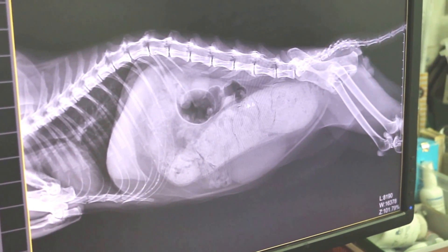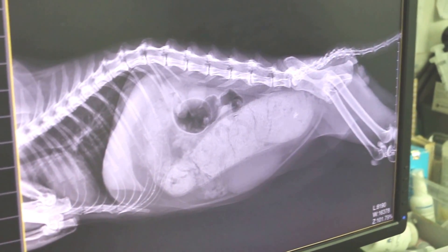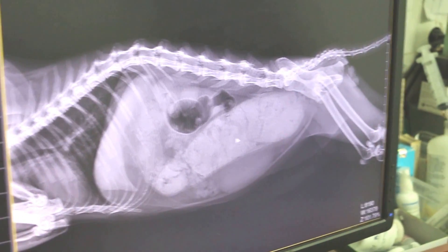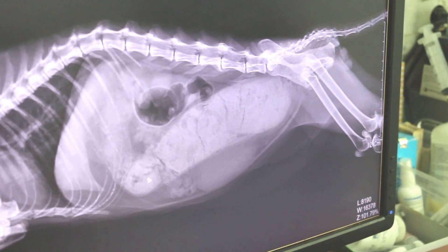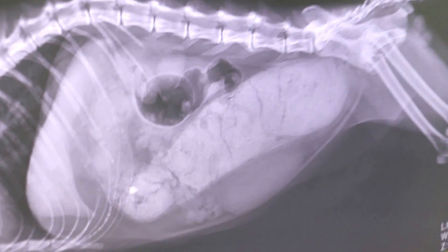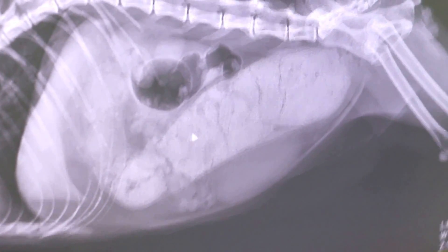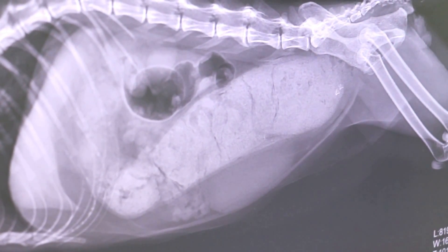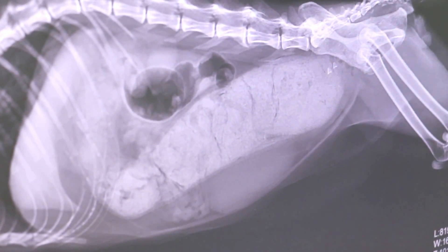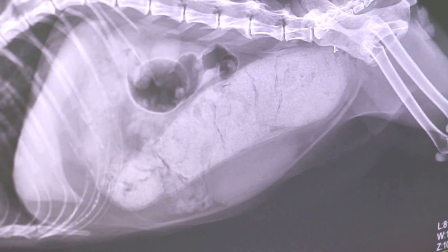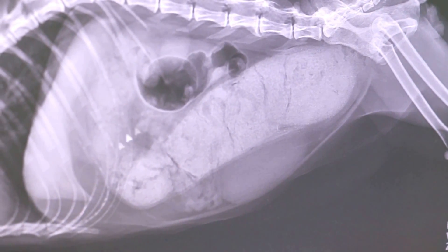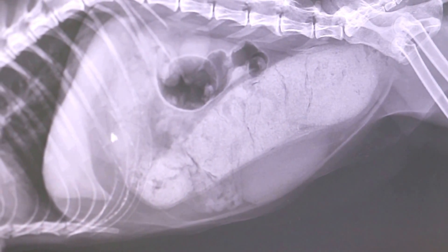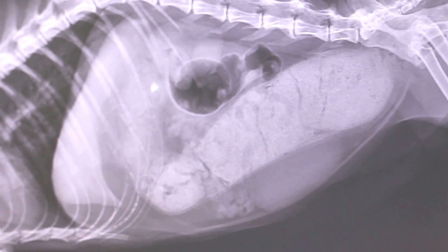The X-ray confirms it — as you can see, these are stools already hardened, dehydrated, and dried up. This is mostly the descending colon — descending means it goes into the rectal area. Then you can see the transverse colon, but not as hard.